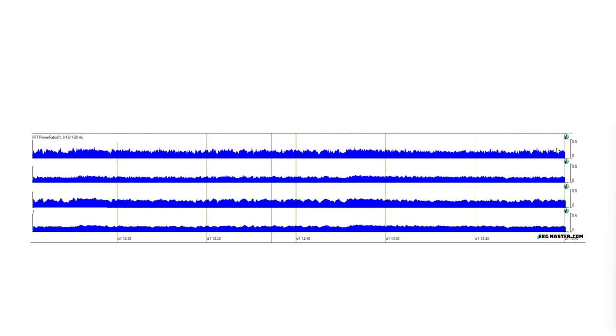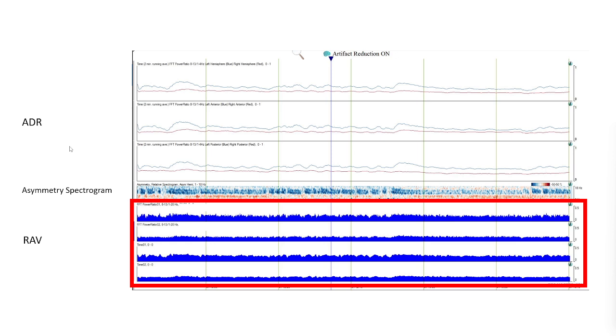This trend, alongside alpha-delta ratio, has been studied for its utility in monitoring for diffuse cerebral ischemia in the setting of subarachnoid hemorrhage. As the ischemia develops, there is a relative drop in the alpha frequencies as well as a decrease in variability seen in alpha power over time.